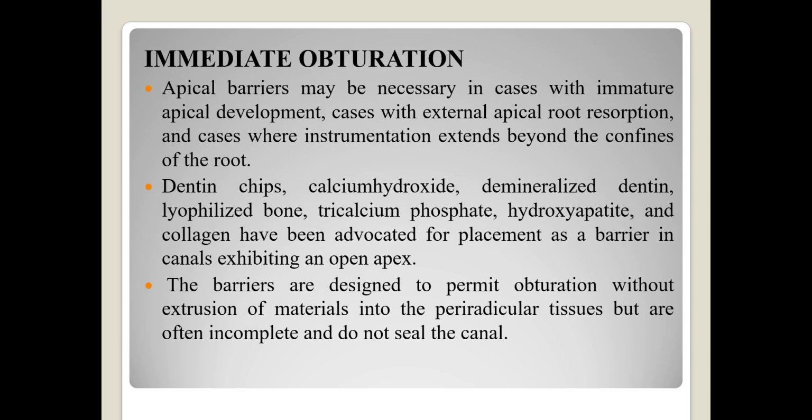Immediate obturation. Apical barriers may be necessary in cases with immature apical development, cases with external apical root resorption, and cases where instrumentation extends beyond the confines of the root. Dentine chips, calcium hydroxide, demineralized dentine, lyophilized bone, tricalcium phosphate, hydroxyapatite, and collagen have been advocated for placement as a barrier in canals exhibiting an open apex.